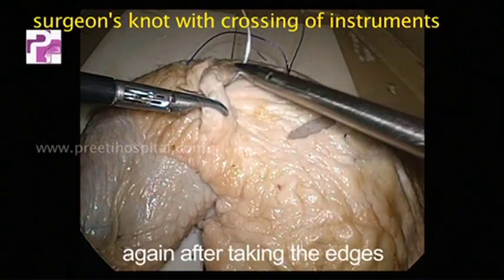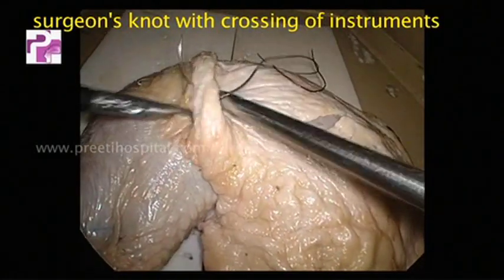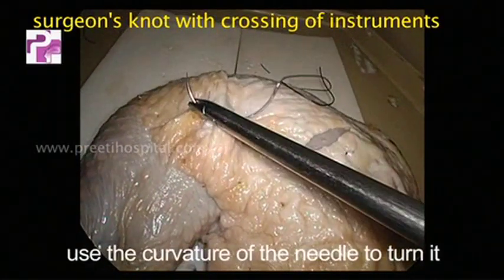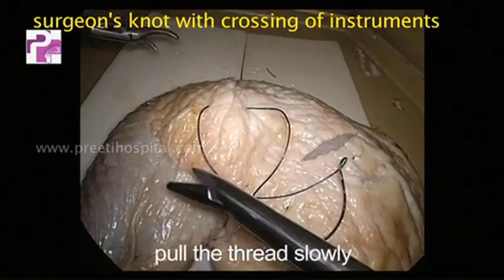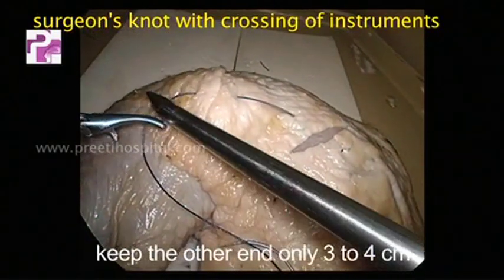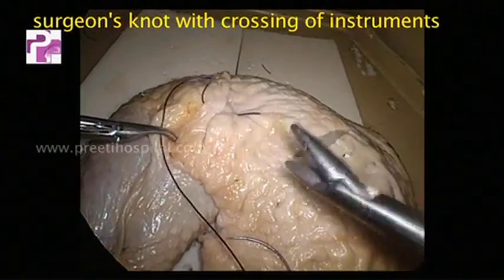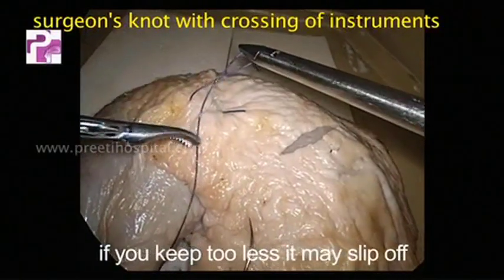Again, after taking the edges both to be sutured, use the curvature of the needle to turn it. Pull the thread slowly and keep the other end only 3 to 4 centimeters. If you keep it too less it may slip off.